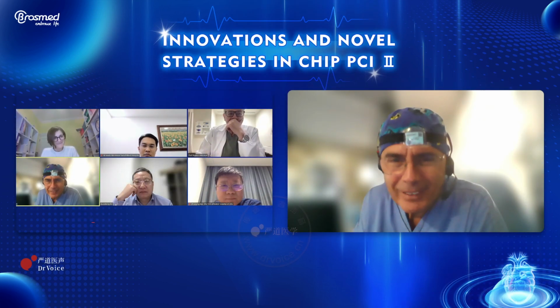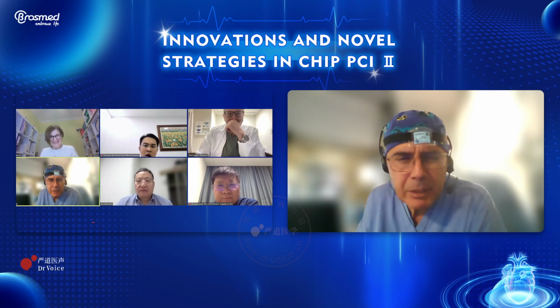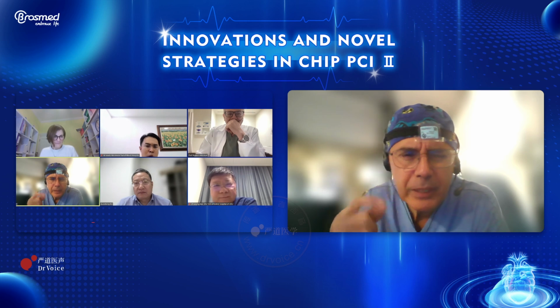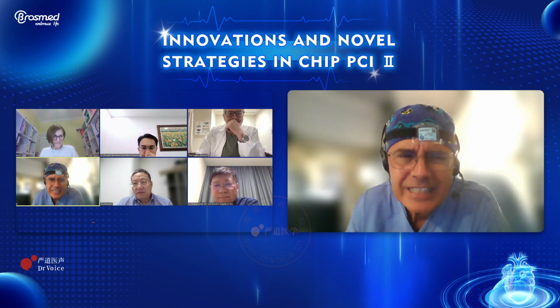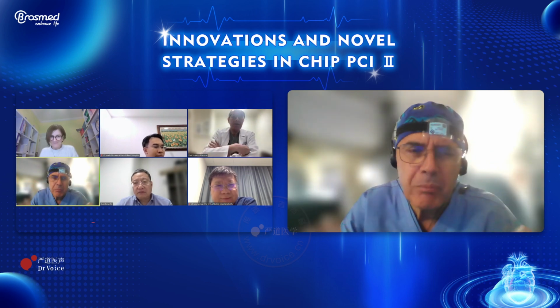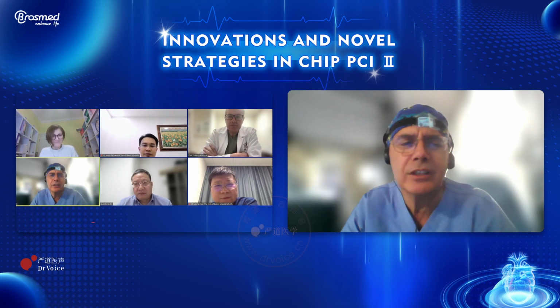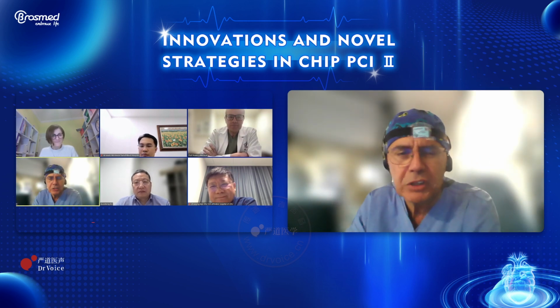Fantastic case in the vein graft. I haven't tried it at the moment, and the next step I will try. Thank you for showing the case. I believe that it's a very important point. I don't believe that the cutting balloon is the specific device for the highly calcific lesion, but for the mixed or fibrotic and calcific lesion it is a very, very good choice.